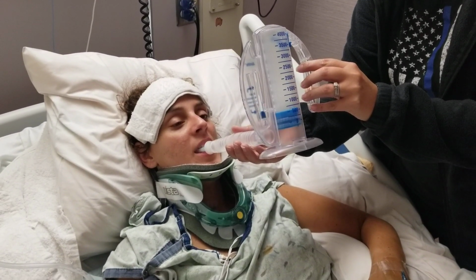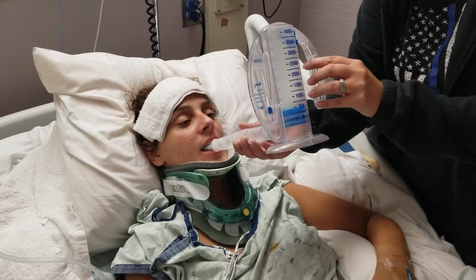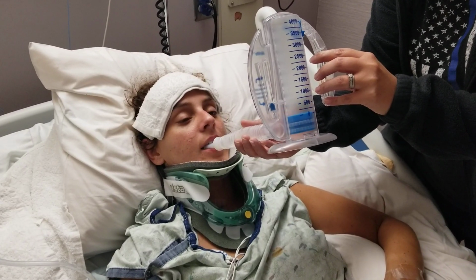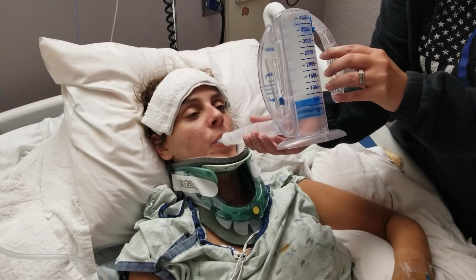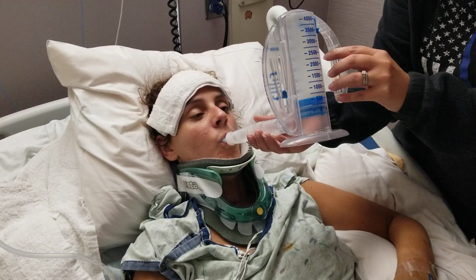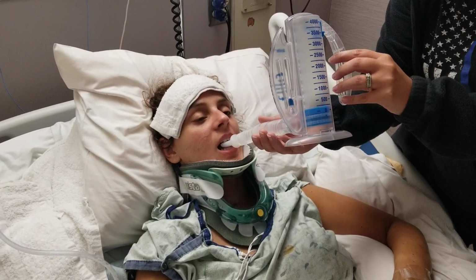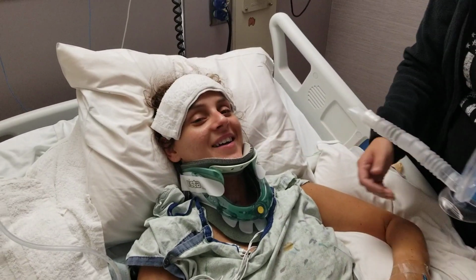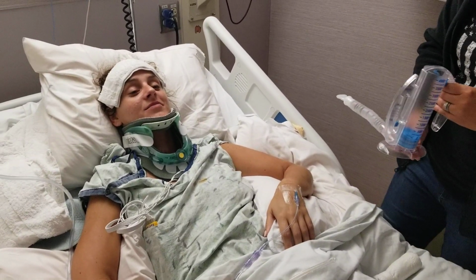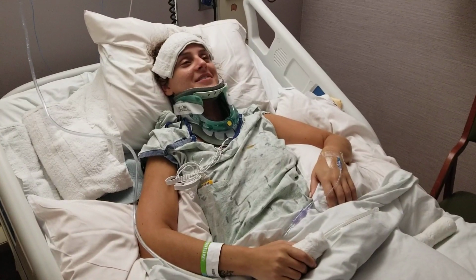So her goal here is to try to keep the little floaty on the left nice and steady right in the middle. As you can see, she's doing a great job with that. And then the big plunger, trying to get that slightly above 500 to 1,000, but they have to work together and be consistent each time. When she first started, she could barely reach 500. And now she's consistently doing that, and the floaty was barely getting up there. So awesome job there. So we'll move on to some range of motion stuff.